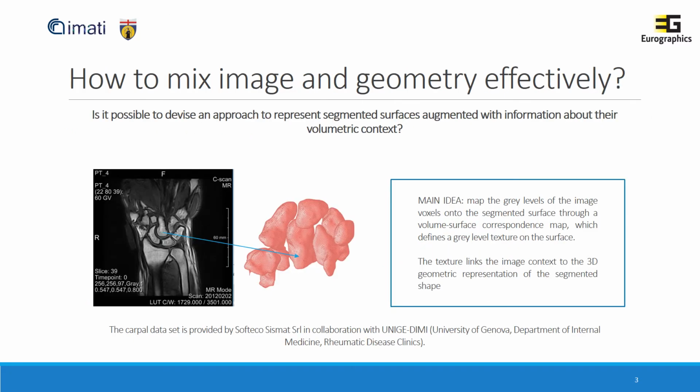The analysis of anatomical structure in clinical practice is fundamental for different aspects that go from early diagnostics, surgical planning, to follow-up evaluation and therapy planning. In this work, we focused on the carpal district, with a dataset composed by 3D MRIs of the district, the segmentation of these images, and the 3D surfaces extracted from the segmentations.